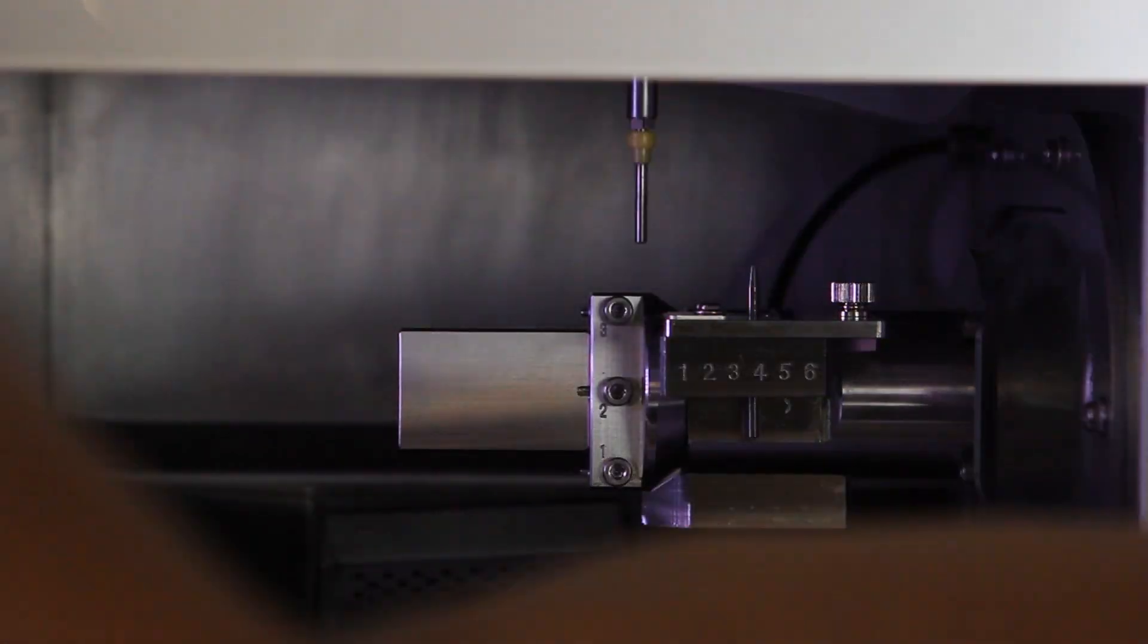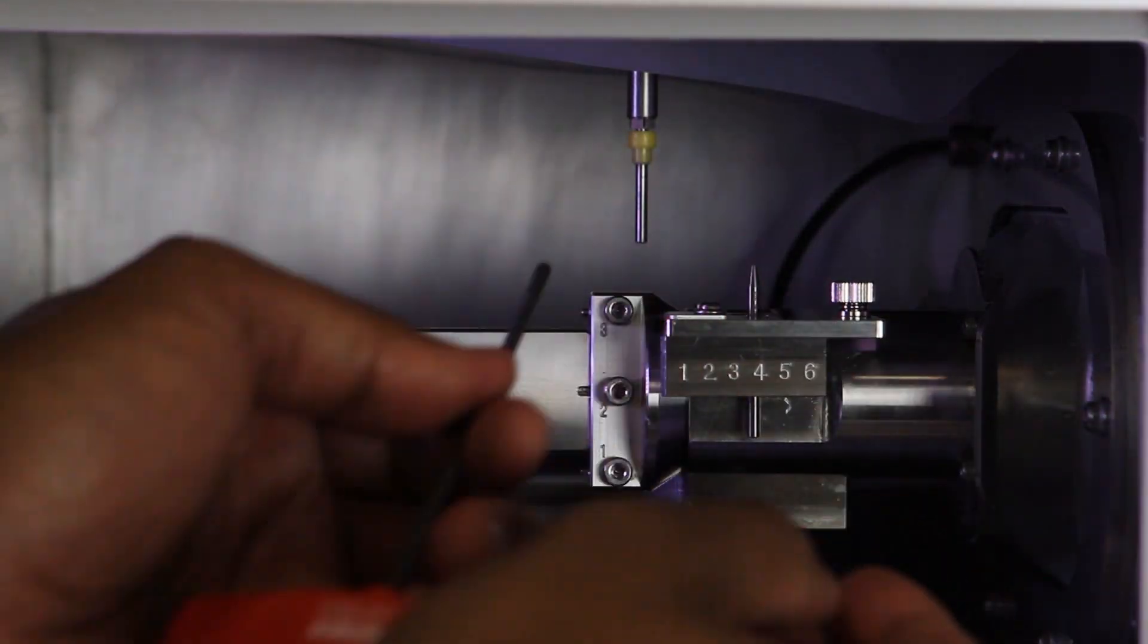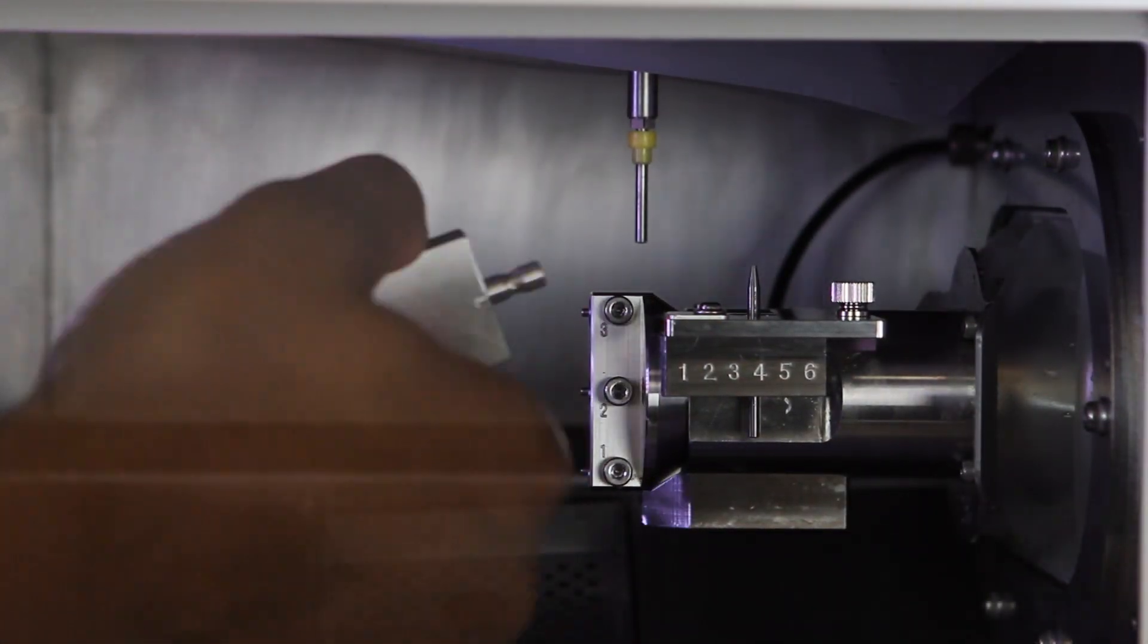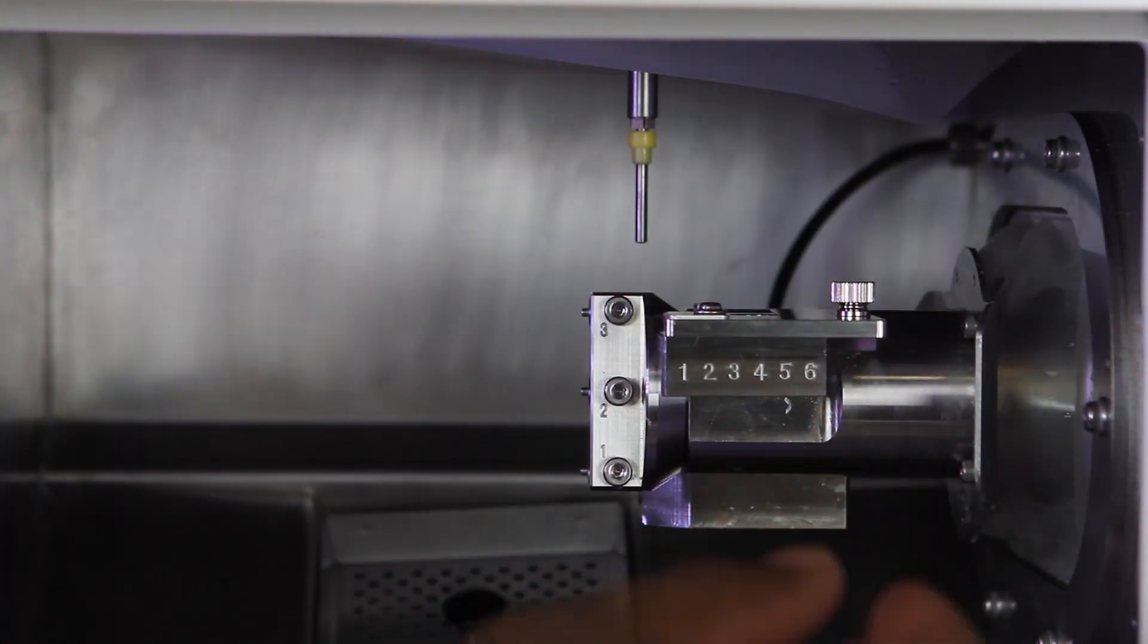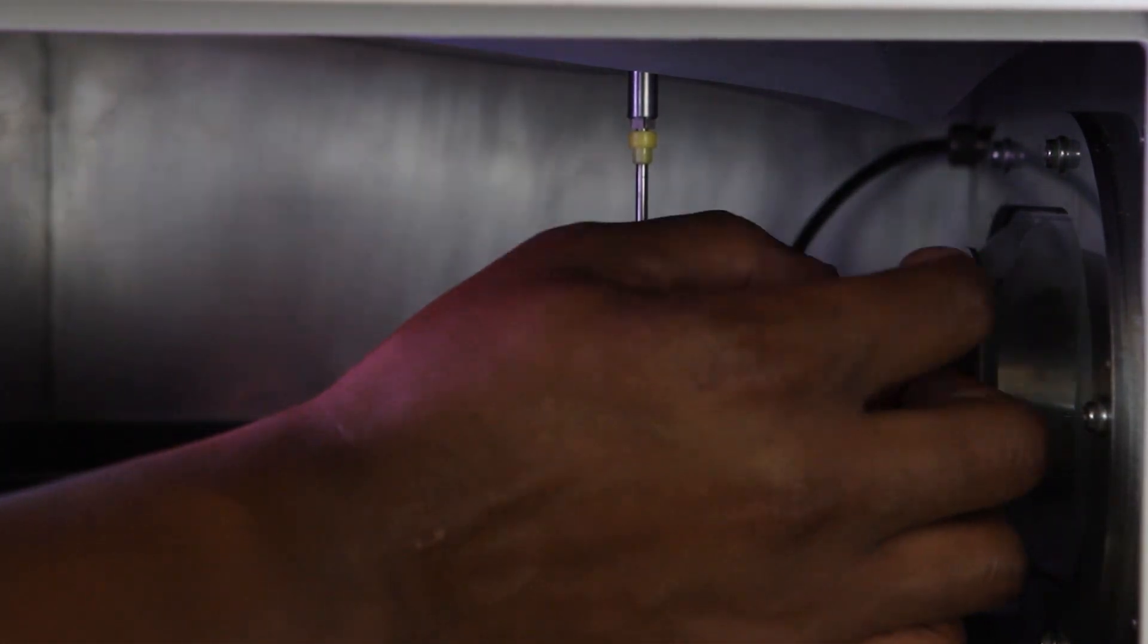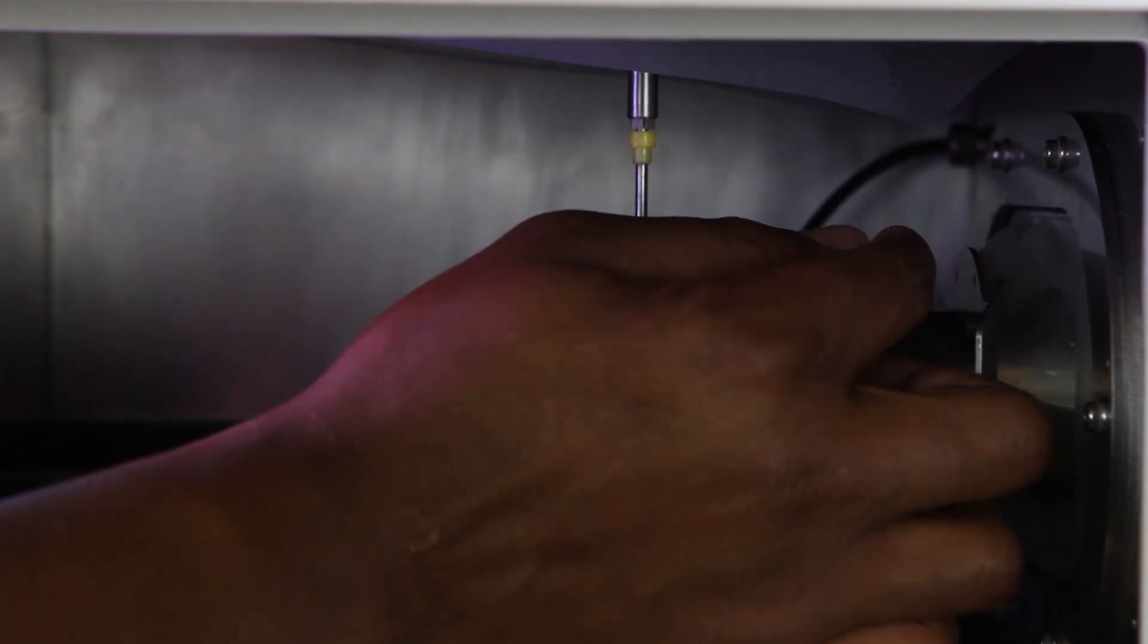Open the front cover and remove the automatic correction jig from the mounting part. Then, remove the detection pin and ATC magazine correction jig from the top of the rotary axis and close the front cover.